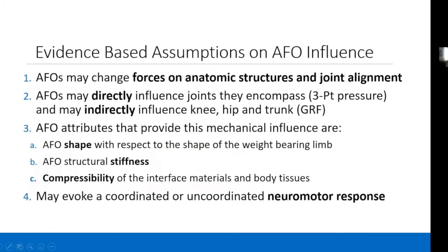So I want to talk a little bit about it today, getting into the assumptions that the algorithm is based upon. Of course, every methodology has to be based on certain fundamental principles. With regard to orthotics, of course, we have a growing body of evidence, but we still don't have a lot of research that demonstrates efficacy of certain approaches to orthotic practice. That evidence base is growing, but what we do have is a lot of fundamental knowledge, of course, about engineering and biomechanics and those types of things. And so the algorithm is based upon a lot of the evidence which would underlie the approach to orthotic design from that perspective. So with regard to that, the assumptions that the algorithm is based on are as follows.